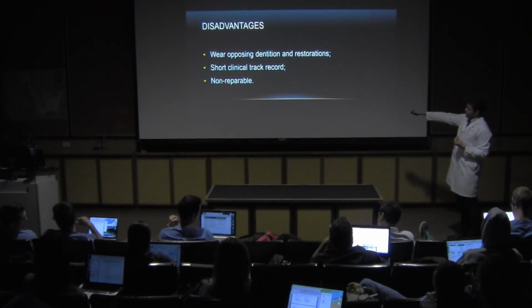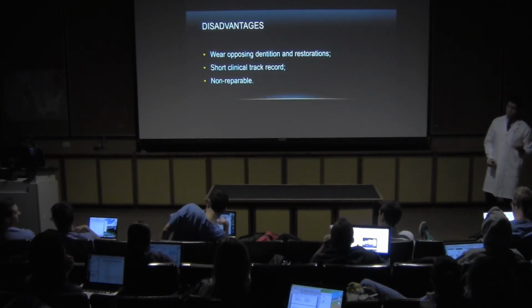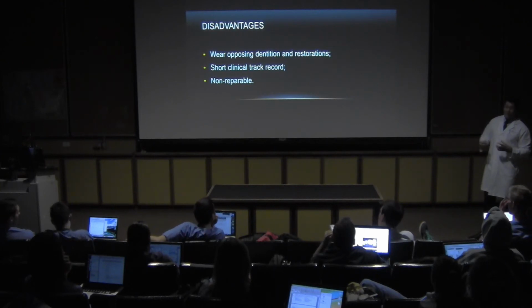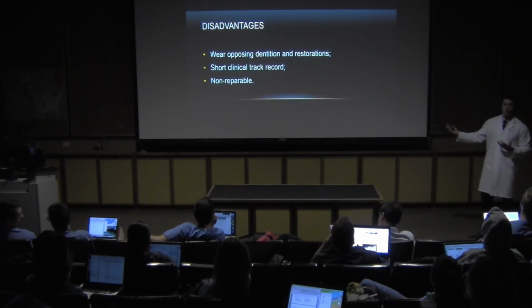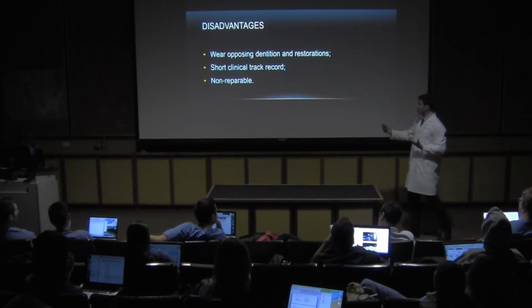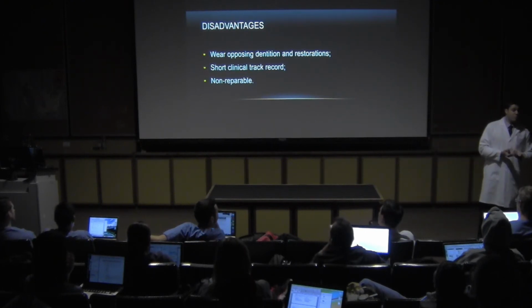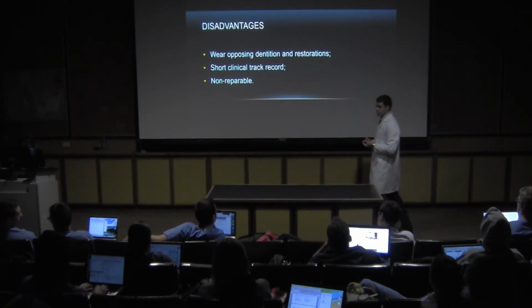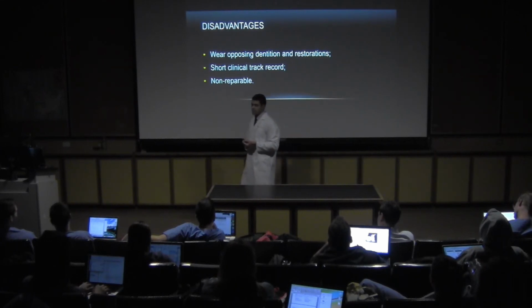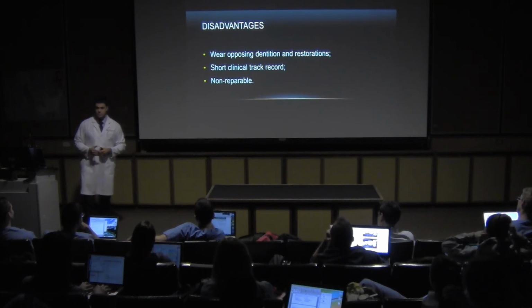Sometimes we are opposing dentition restorations because it's hard. We don't have a big clinical record as with amalgam restorations, like we have 25, 30 years inside the mouth. We don't have this with indirect procedures yet. And another important thing, they are non-repairable. If the ceramic fractures, we cannot repair the ceramic. We cannot put a composite resin there. It will fracture in the next 15 days.